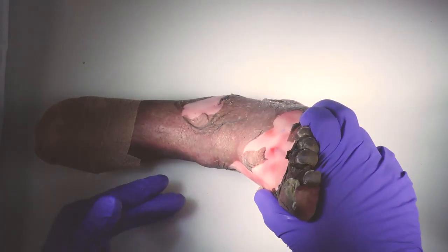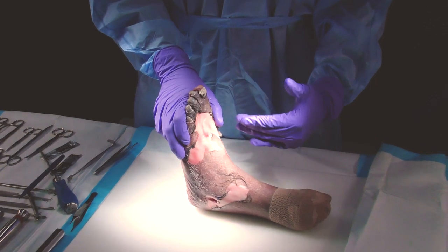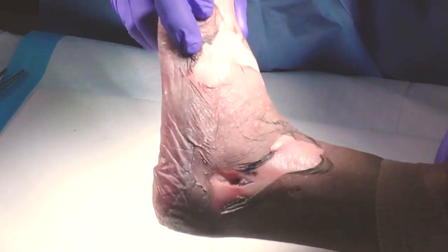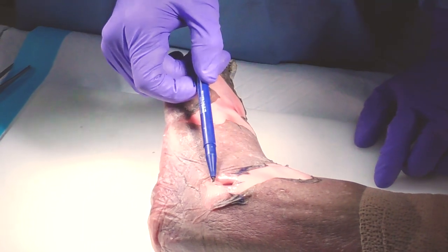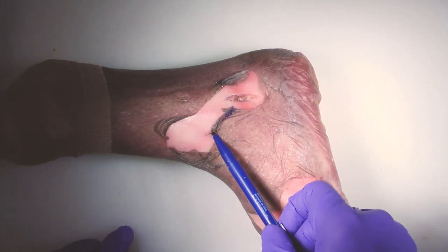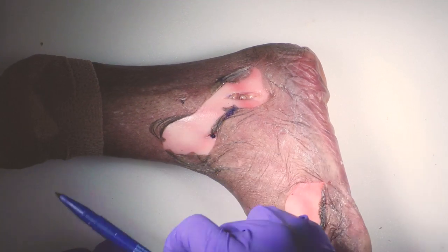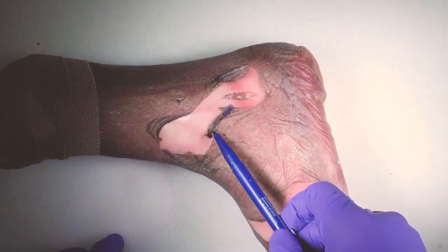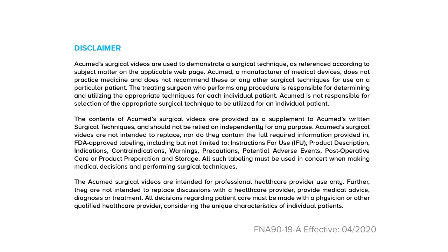I like to compare with the other extremity, so I typically put both legs in the operative field so I can confirm that both ankles look the same in terms of length and rotation. Now we can take a look at the incisions: 1.5 centimeters for the main entry, half a centimeter for the anterior locking, and half a centimeter for the proximal locking screws. You can add another screw proximally or distally, but I typically think this is more than enough.